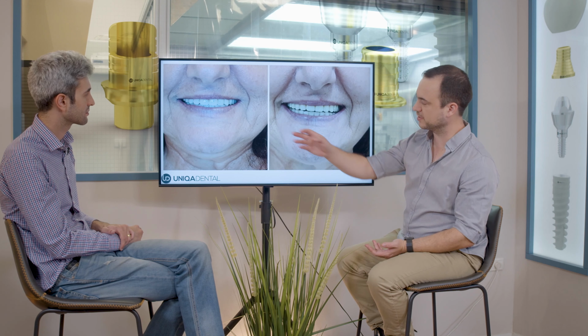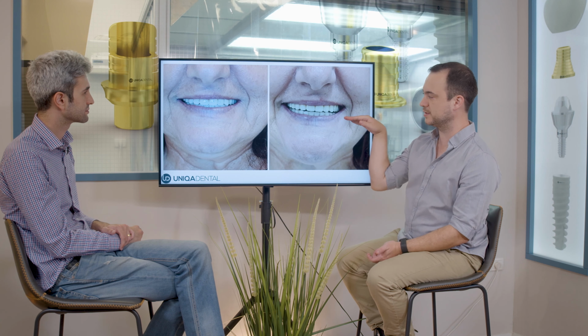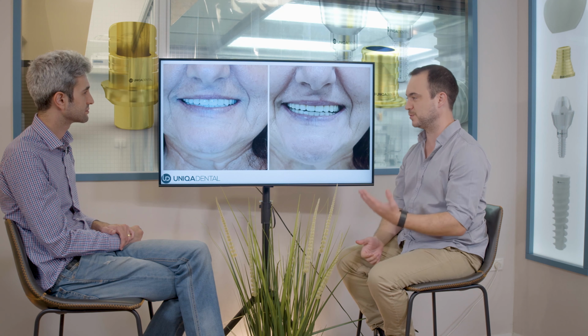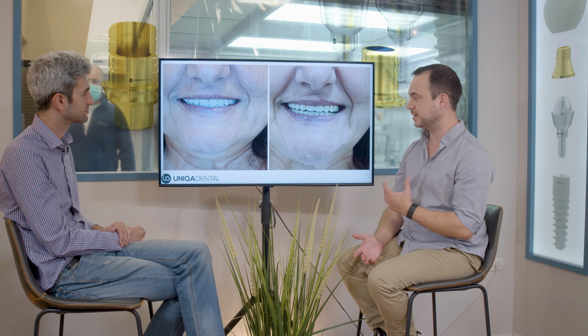So here you can see the bridge is a little bit whiter and here a little bit yellower. But all in all, you can see that all of her teeth are on the same level. It's much better than what she had before. And the midline is great. The smile line, lip line, everything looks fantastic.